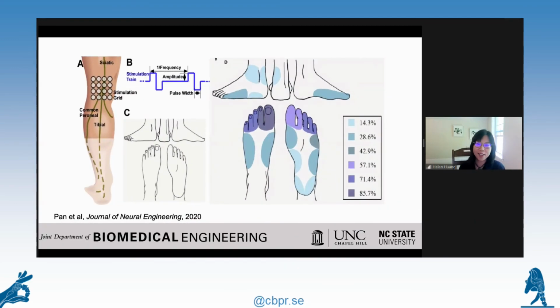Well, we haven't closed the loop yet, but I want to show you, we have tried some neural stimulation, but this is non-invasive, transcutaneous stimulation. We would be able to hit multiple places, like the toe or heel of the missing limb being felt through this stimulation. And then we also had a very hard time actually hitting the heel. I don't know why, maybe because it's transcutaneous stimulation. But we're definitely interested to learn more from the invasive approach, what was generated out of their stimulation study.